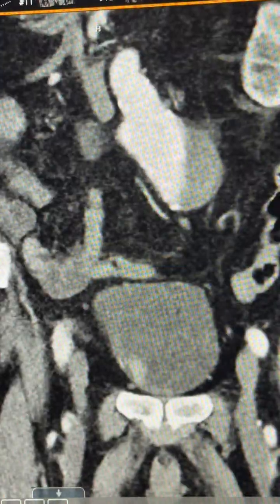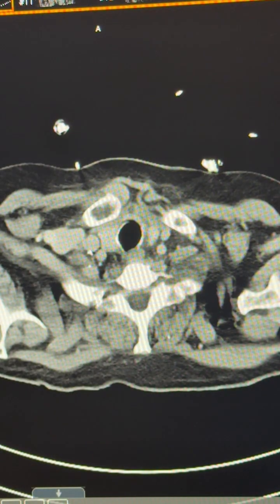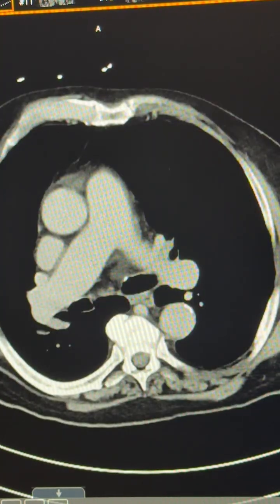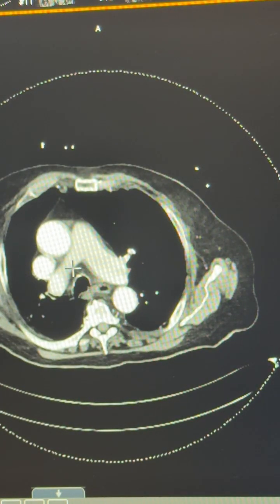No, that's just the rough estimate measurements. Now you go to the real measurements, which is this, and 125. Nope. There we go. Let's zoom in more.